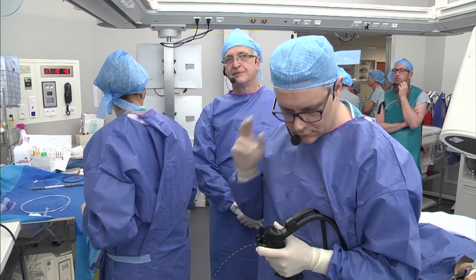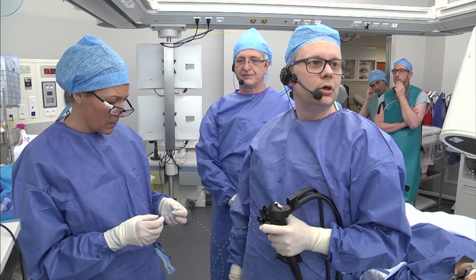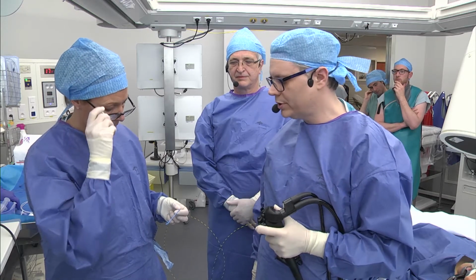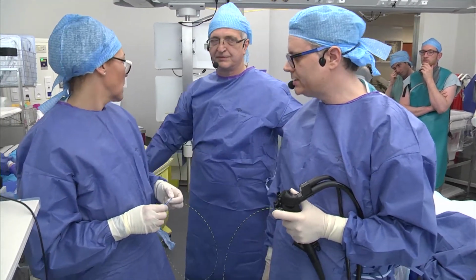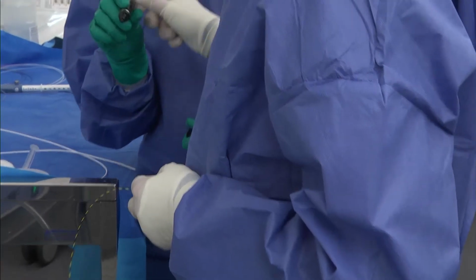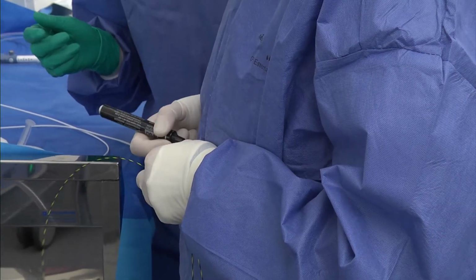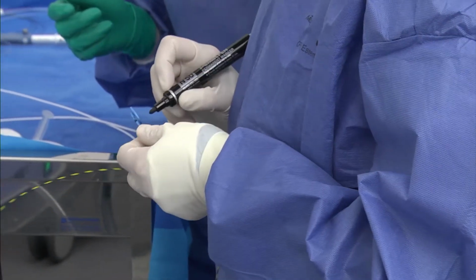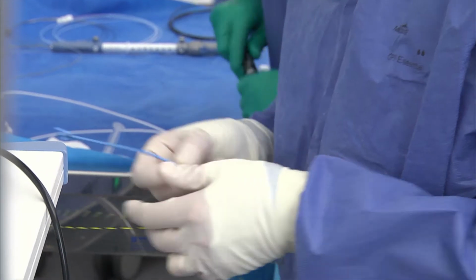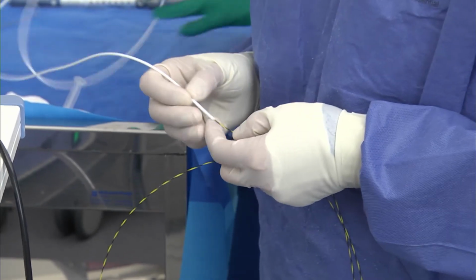What size of pigtail will you use? Here is a 7 French, 7 centimeters, longer than the metallic stent, and the diameter is not very important. 7 or 8.5 French is enough. I would not use an 8.5 in this particular case, because the size of the pigtail in the 8.5 is much larger and will not be adapted to the size of the common bile duct. So in this case, it's just to prevent migration. Let's make it as simple as possible, and this is why Erwan has chosen the 7 French.